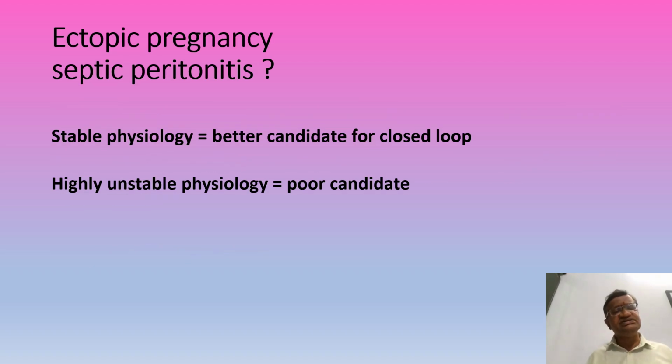Can we do it in ectopic pregnancy? The problem here is stable physiology: closed loop is better. Unstable physiology: not a good candidate. This we should remember.